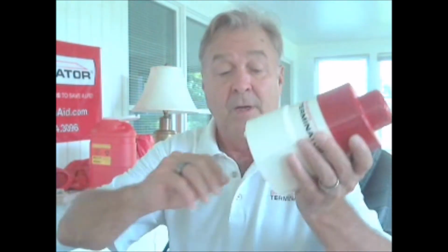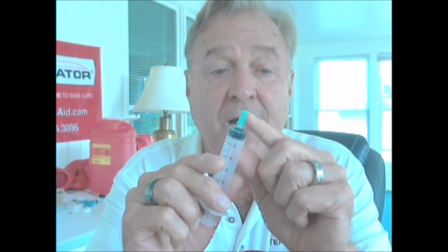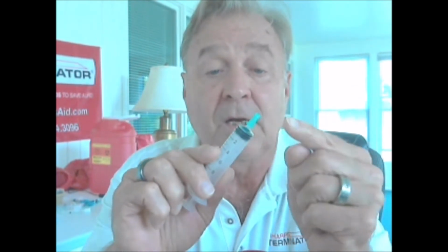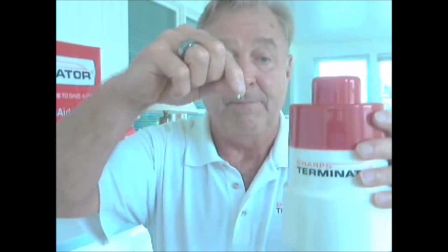Okay, the second issue has to do with the Swarf tube. After you finish a procedure, the needle is incinerated, and then the blade will cut the hub of the needle. This is the hub of the syringe, which attaches the needle to the syringe. So a blade is going to cut that. This piece, the needle's been incinerated. This piece is cut. It drops to the bottom of the unit and falls into the Swarf tube. You can do 30 procedures before you have to change this.